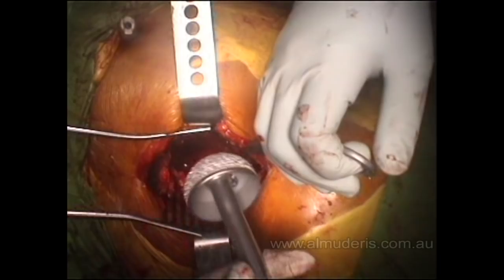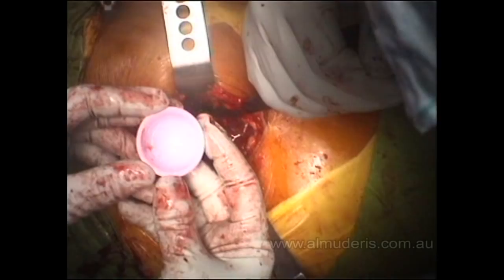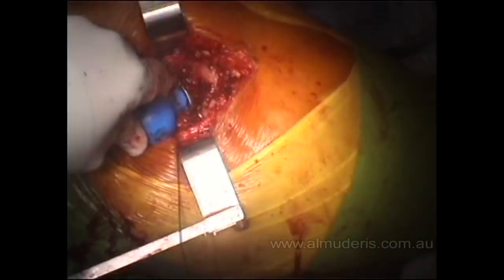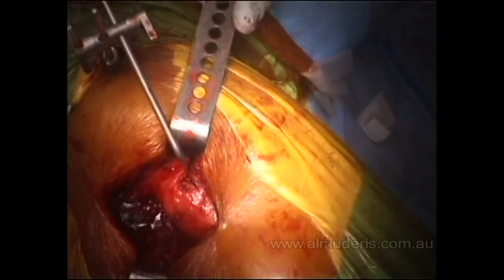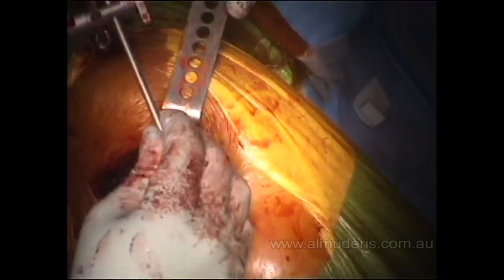The best way to insert the cup is by a rotatory fashion until we bottom out. That is a ceramic insert, which has the lowest friction rate. We use a trial and double-check with the caliper — our measurement is within one centimeter, the difference is only three millimeters of lengthening, and that is what we expect. That is good.